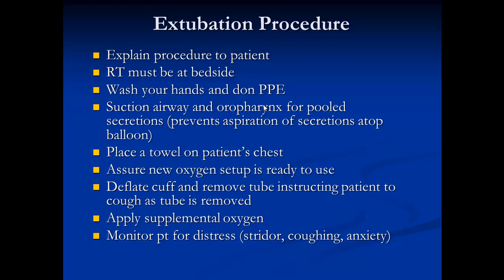And of course, as soon as you extubate, monitor the patient for distress. Listen to the neck for stridor with the bell. Tell the patient to speak to be able to monitor laryngeal damage or vocal cord damage, and also the patient's coughing reflex and anxiety level. Thank you very much for allowing me to explain the modes of mechanical ventilation. So basically, in class, we'll go over case studies and adjust mechanical ventilatory parameters.